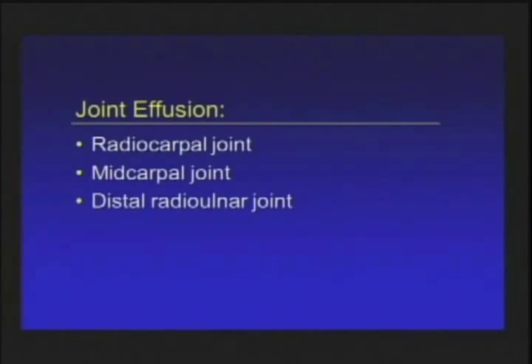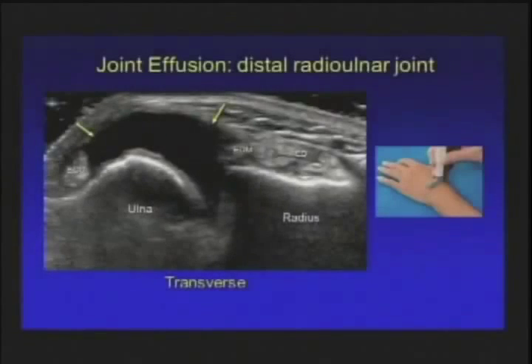one of these spaces. Now the recesses both go volar and dorsal, but the dorsal recess is really where the money's at, meaning that's where they tend to distend more. There are less tissues in the way. That's where I tend to put my needle for aspiration or injection.